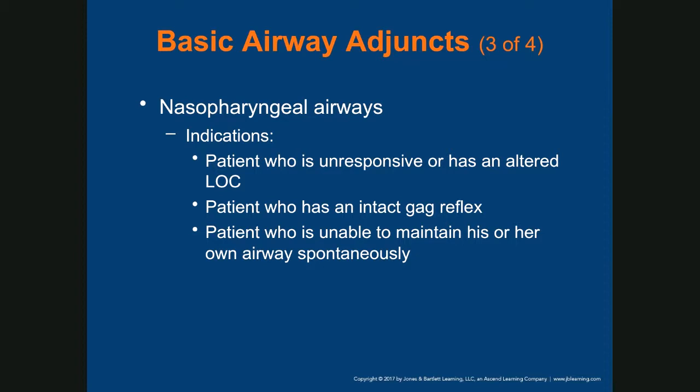Then we have the nasopharyngeal airways. Indication: this is a patient who might be unresponsive or semi-responsive or have an altered level of consciousness, but they have an intact gag reflex and they are still having a ventilation problem.